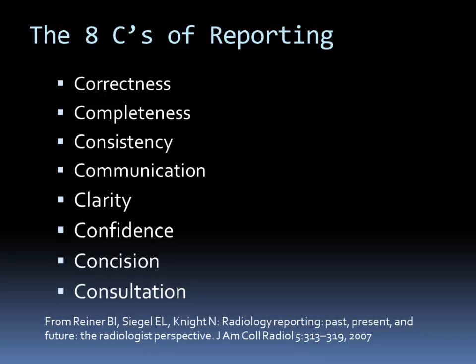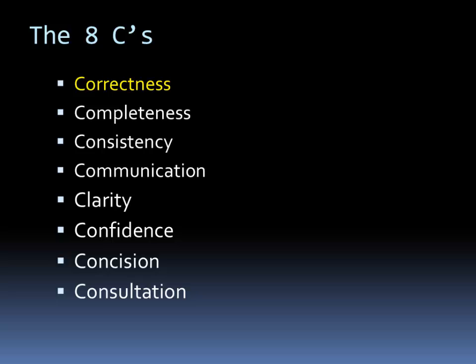So in terms of a framework for reporting, I like to refer to these 8 C's of reporting, and this applies to any sort of radiology reporting, but particularly for PET-CT, and this comes from an article by Bruce Reiner and colleagues. The 8 C's are correctness, completeness, consistency, communication, clarity, confidence, concision, and consultation. Now, correctness you'll see is at the top of the list, but ironically, I think this is actually one that I de-emphasize a little bit.